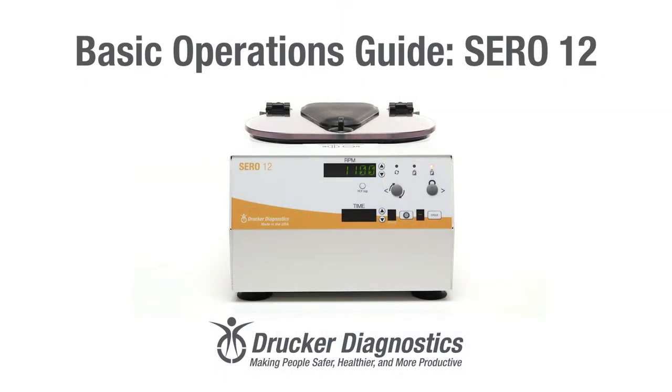Hi, I'm Dawn with Drucker Diagnostics and today we're going to review the basic functionality and operations of your SERO 12 blood banking centrifuge. If you're looking for instructions on something specific, check out the chapters located at the bottom of this video and you can skip right to it. All right, let's get started. Basic Operations Guide, SERO 12.